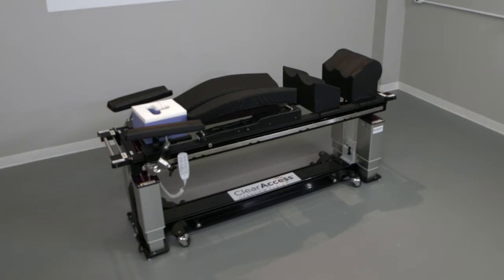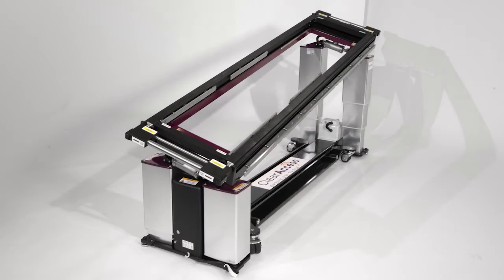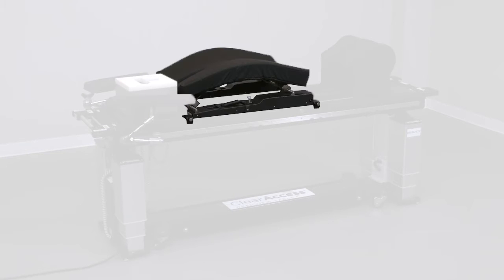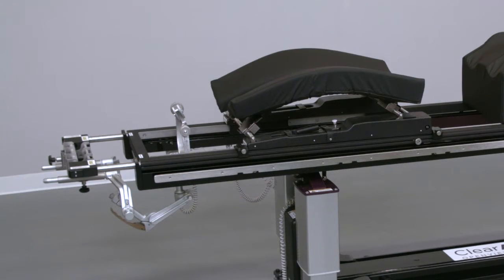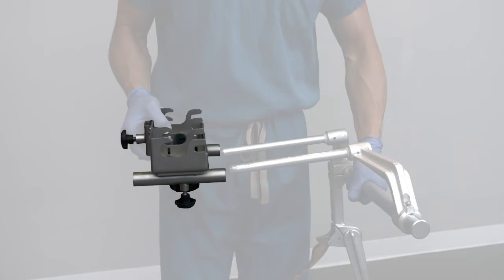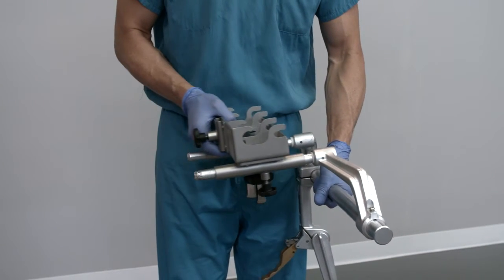Like the new standard configuration, the neuro-cervical configuration begins with the Clear Access Table Base and two tabletops: the supine platform (flat top) and the prone platform (open top). It also includes the Clear Access Head Support, multi-directional arm boards, the flex frame spine frame, and leg management system. Importantly, it also includes the OR Safety Cranial Stabilization Adapter and Rope Traction Device. The Cranial Stabilization Adapter is compatible with the base units of most cranial stabilization systems, including Mayfield and Doral.